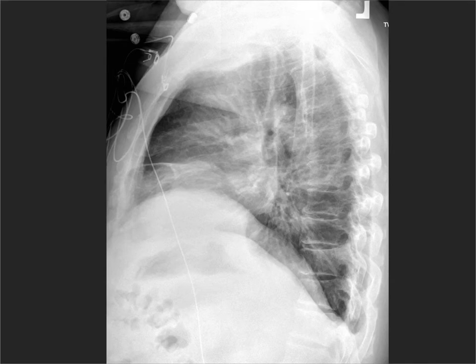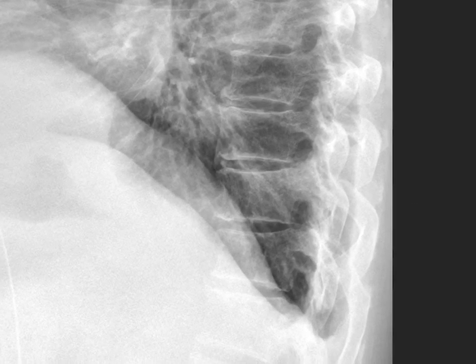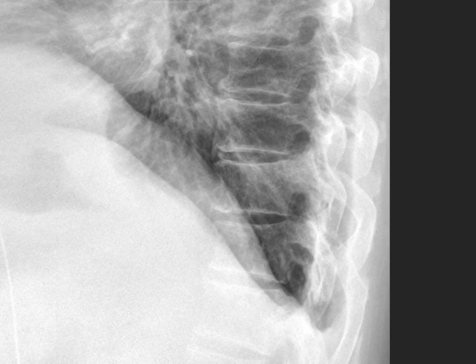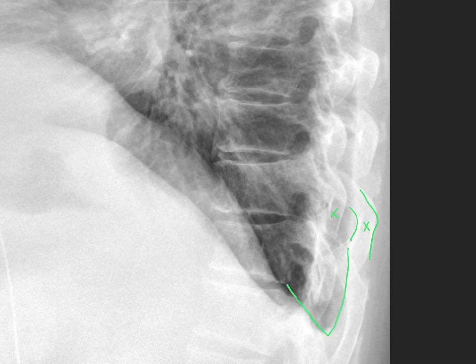Here's a lateral chest x-ray. I'm going to zoom up so we can look at the back side. Here is one set of ribs, here's the other set of ribs — see how this one is magnified? That's because it's on the right. This whole right hemithorax is magnified compared to the left.